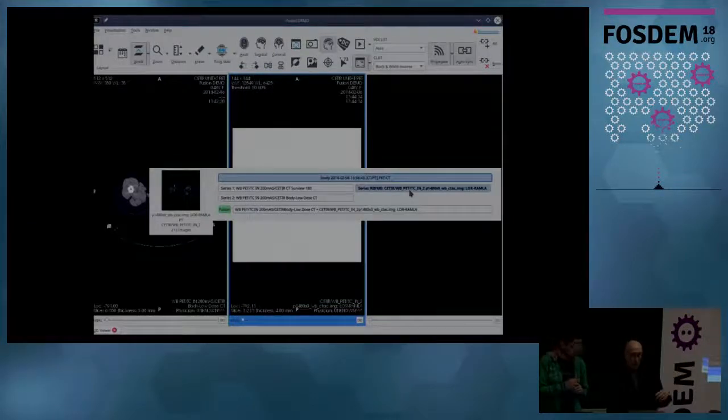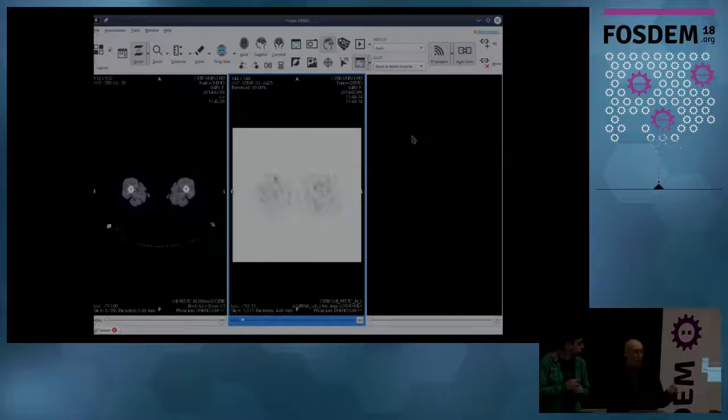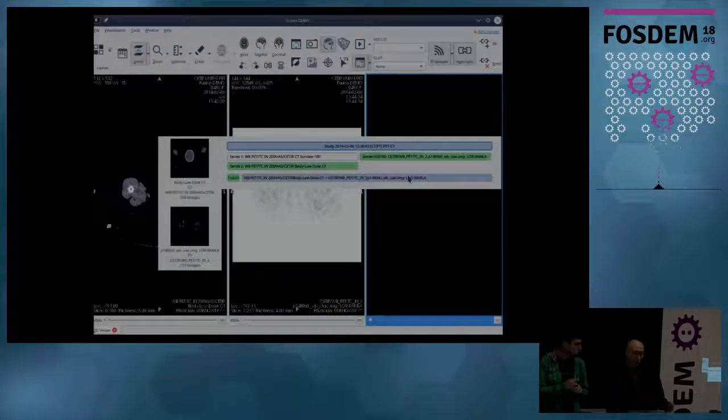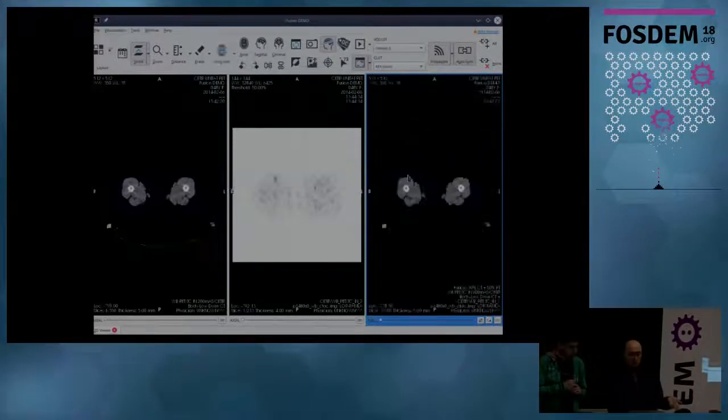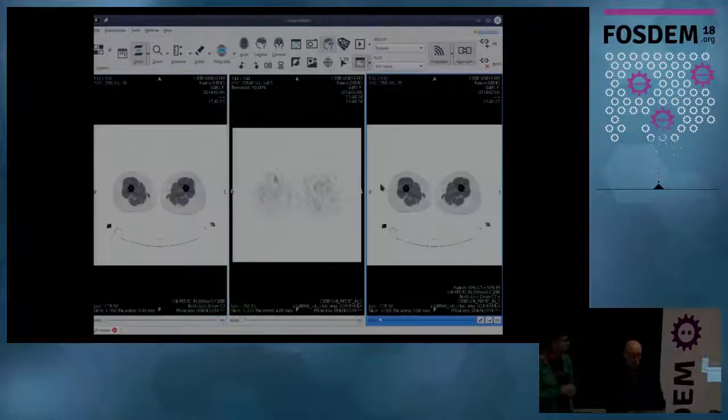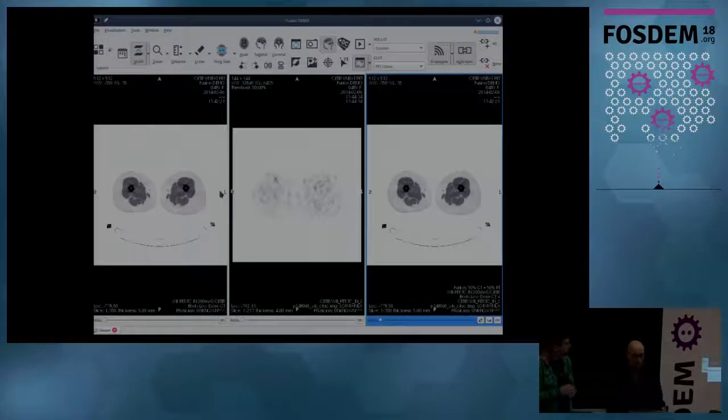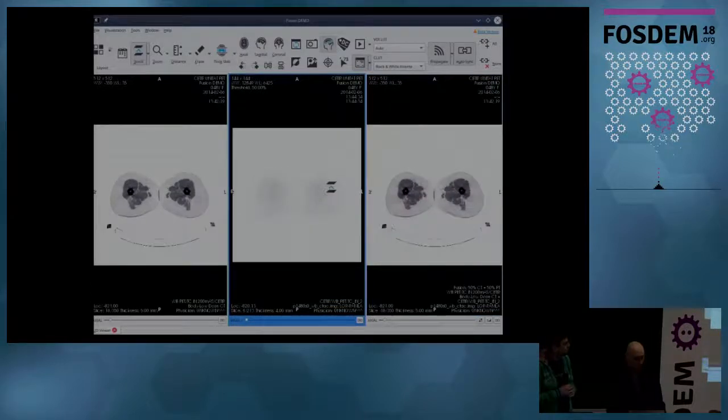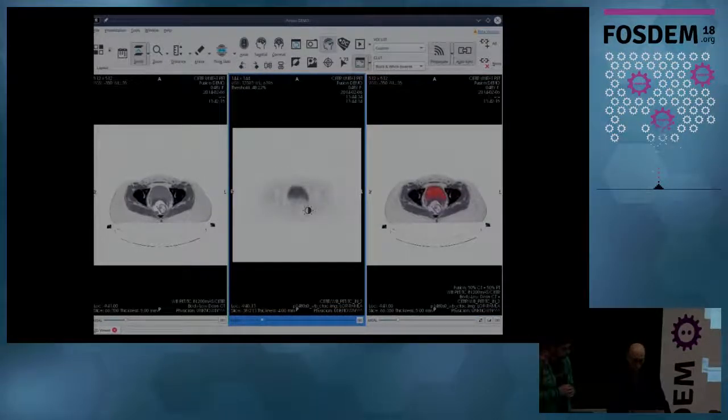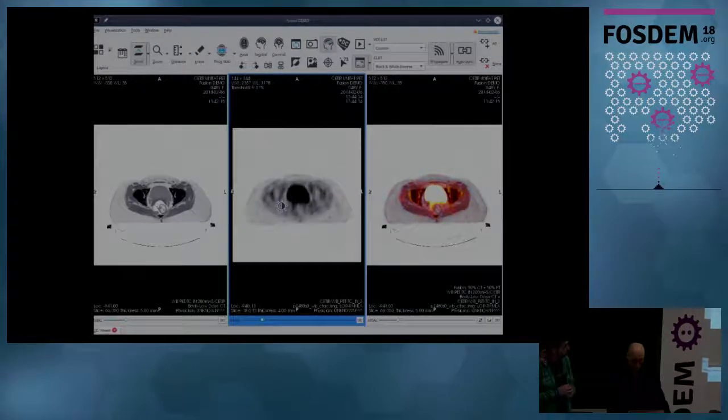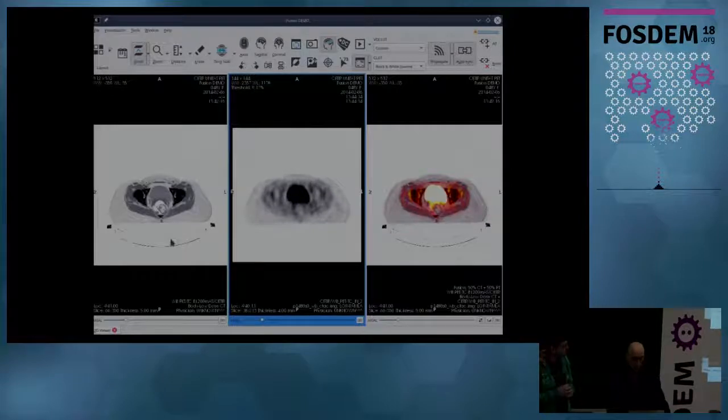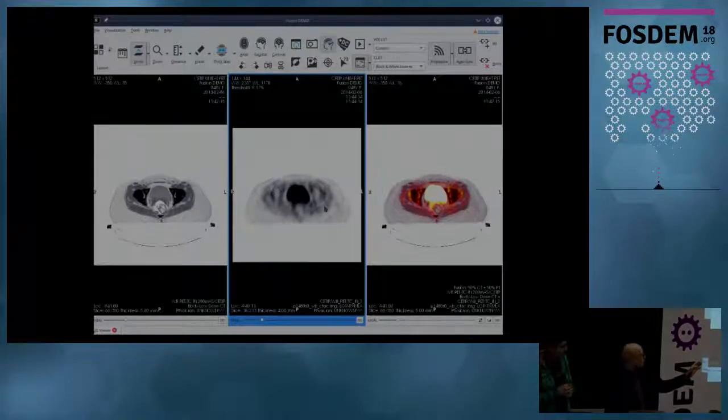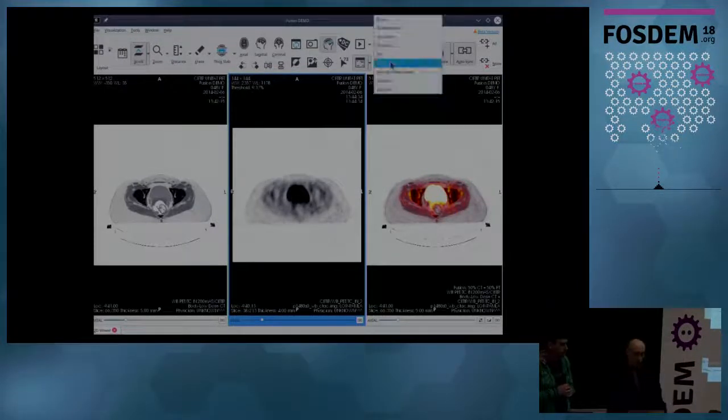And here I have another series, which is the PET scan. This is nuclear activity. And in this third empty viewer, I will put the fusion of these two series. I will invert the colors to ease your task. Then, if I move this here, we can see that there is a more active region. And this is the fusion. One is the normal, this is the CT scanner, and this is the fused, this is the resulting fused image.